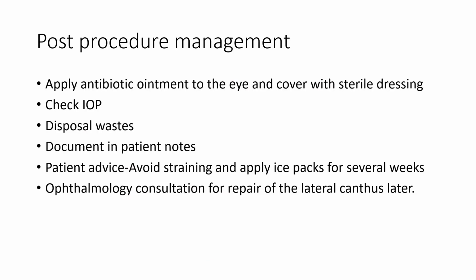Now, post-procedure management: apply the antibiotic ointment to the eye and cover with sterile dressing. Then check the IOP. Usually we can use a tonometer, or you can digitally palpate and compare with the other eye to see whether there is any improvement. Then we should dispose of the waste in the sharps bin, and document the procedure in the patient notes. Give the patient a printed leaflet with advice to avoid straining, and the patient should apply ice packs for several weeks.